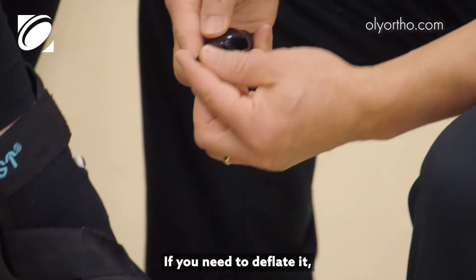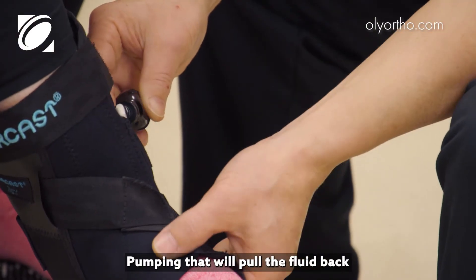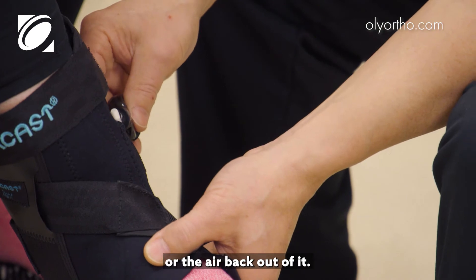If you need to deflate it, just put the pump in the opposite direction and pump — that will pull the air back out of it.